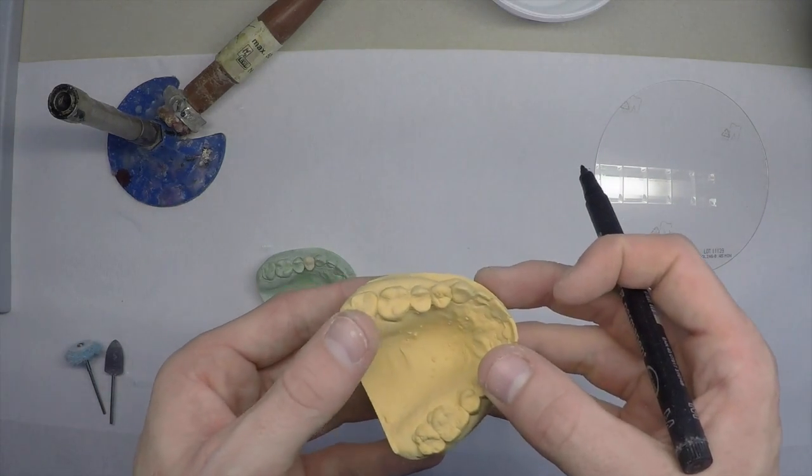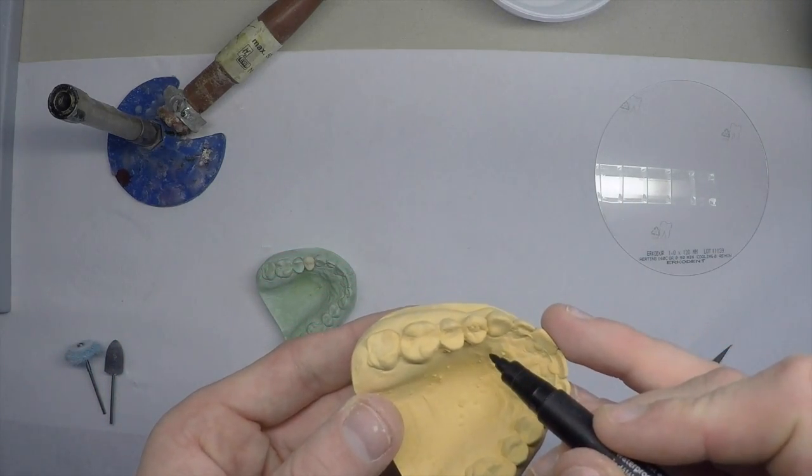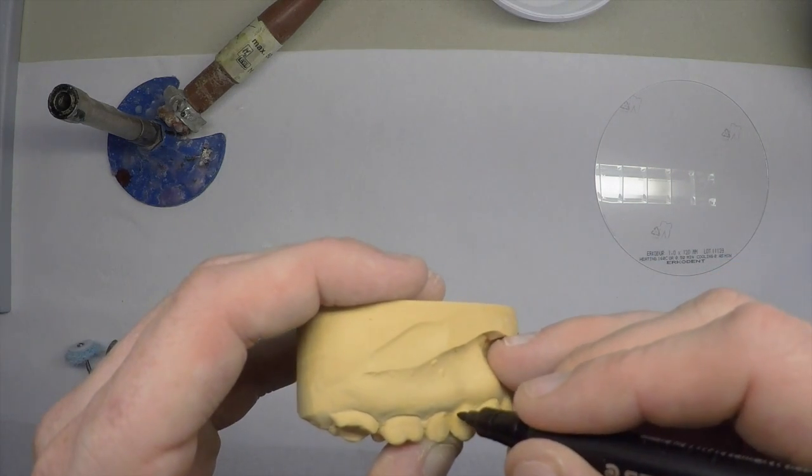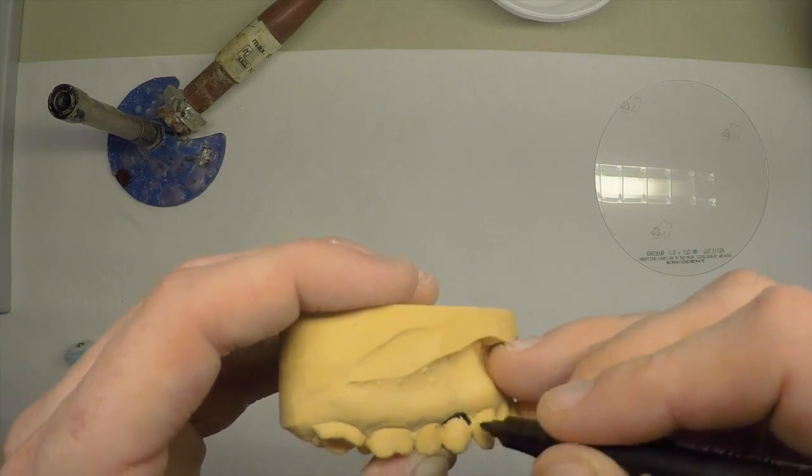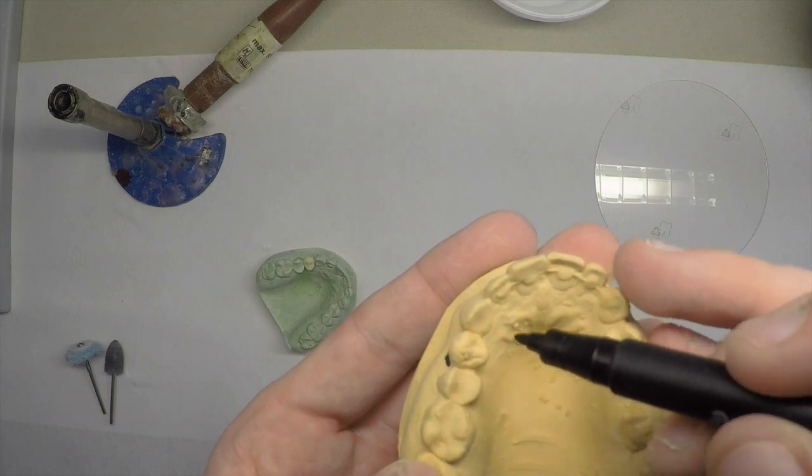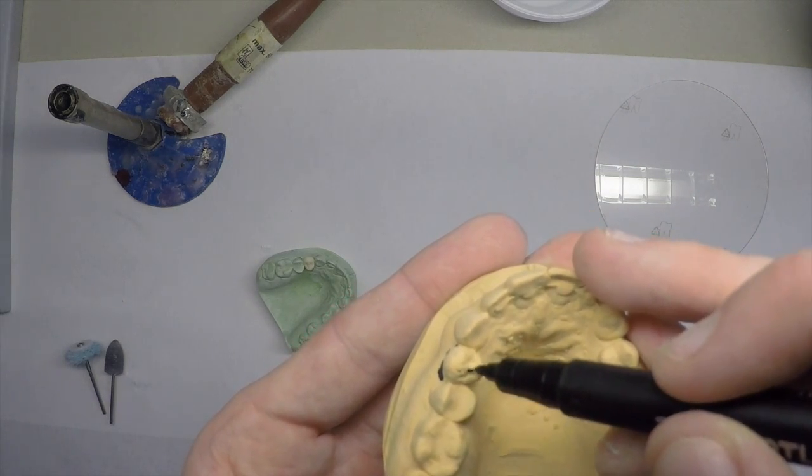We want to mark a few areas on the model. In this case we're placing an implant in tooth 1-4, so we want to mark the gingival margin first. Then we also want to mark where we would expect or want the screw access hole, which is going to be just slightly lingual to the centre of the tooth.